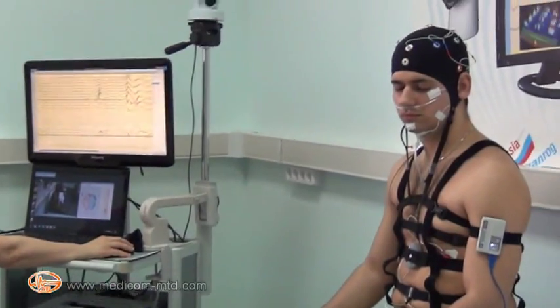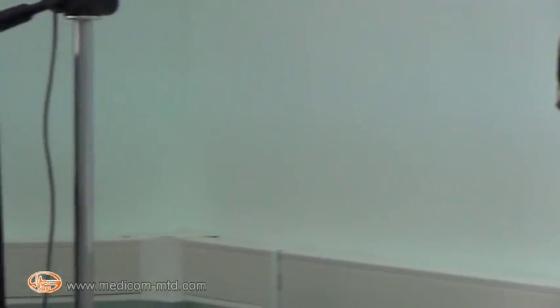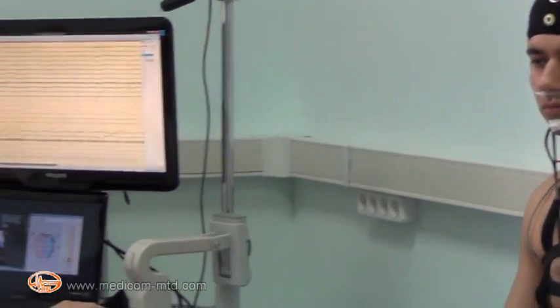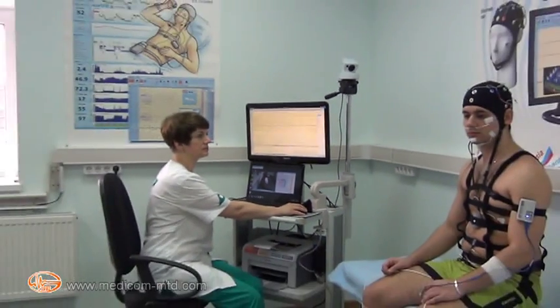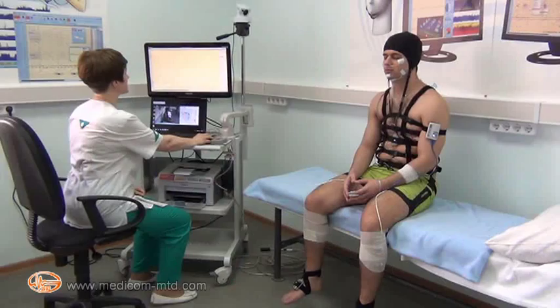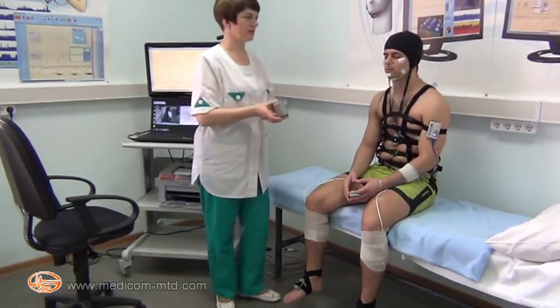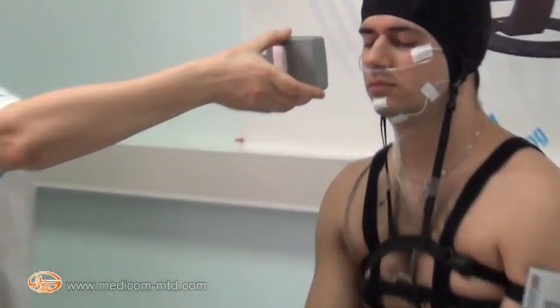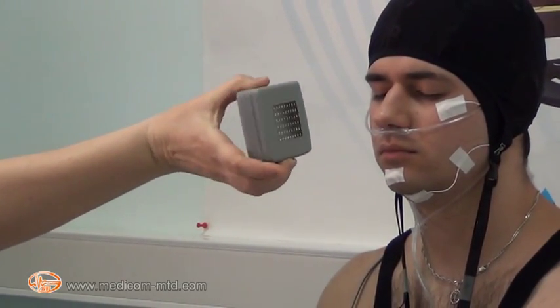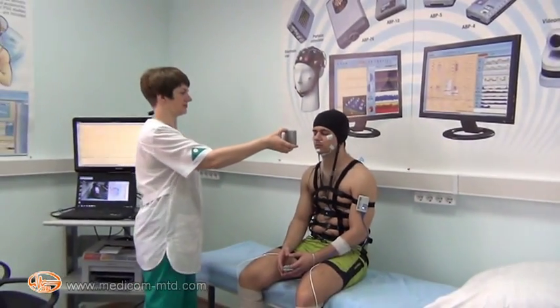Execution of the standard scenario: patient with eyes closed, then with eyes opened. The autonomous transceiver recorder ABP with wireless control of stimulation via Bluetooth channel is used to carry out functional tests with photo-phono stimulation in telemetric mode. Photostimulation can be carried out using the integrated LED matrix, set at a distance of about 25–30 cm in front of the patient's eyes.